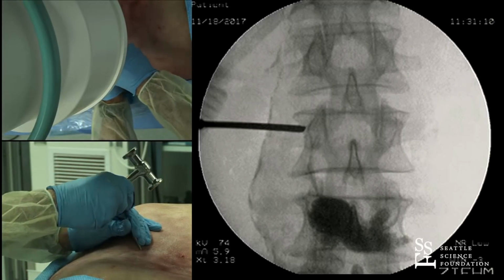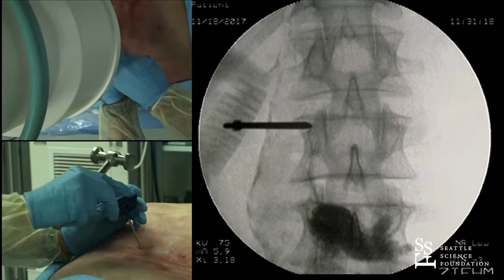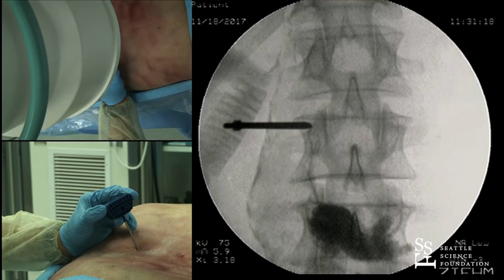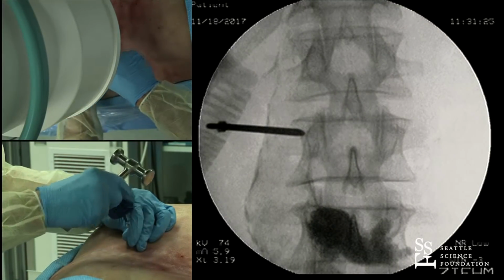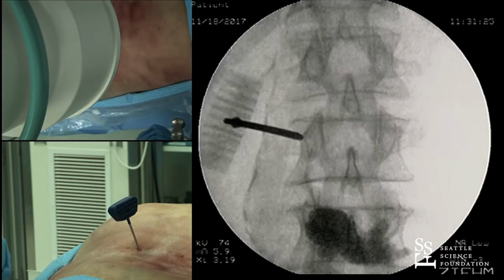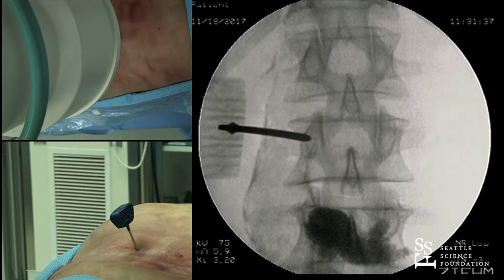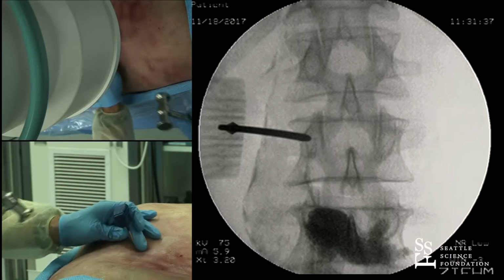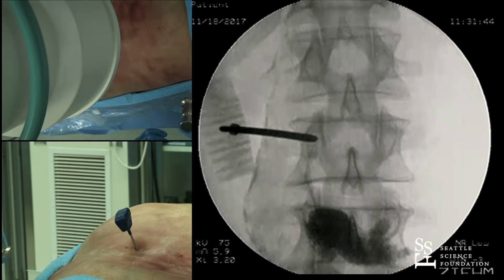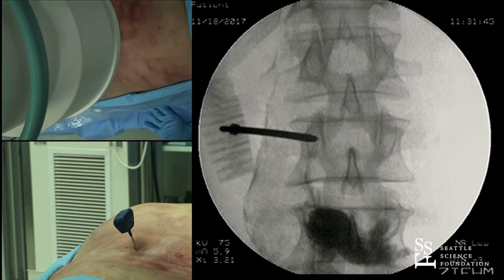Does the needle tend to follow it each time? Yes, but remember it's osteoporotic, so it's very easy for the Jamshidi to act like a straw in a milkshake. It'll wiggle on you. And Doug had commented about causing pedicle fracture with an intrapedicular approach, a transpedicular approach, as you gear shift the Jamshidi. So you want to be mindful that in the osteoporotic bone, you can literally move this with almost the force of your breath. Neil's giving good tips. I can hear him.